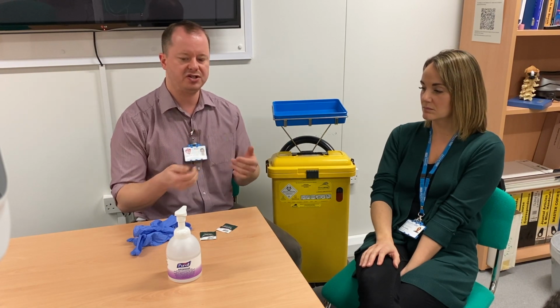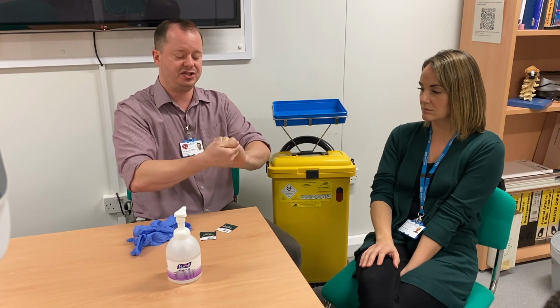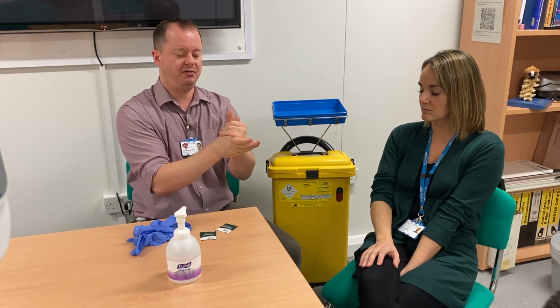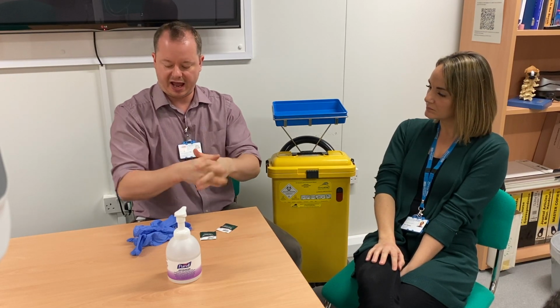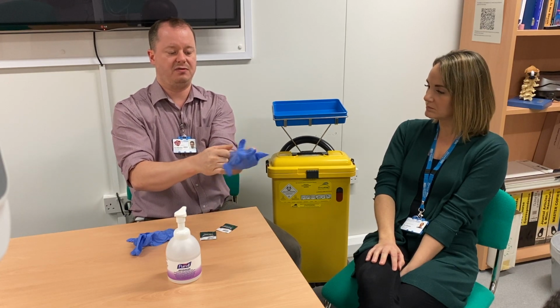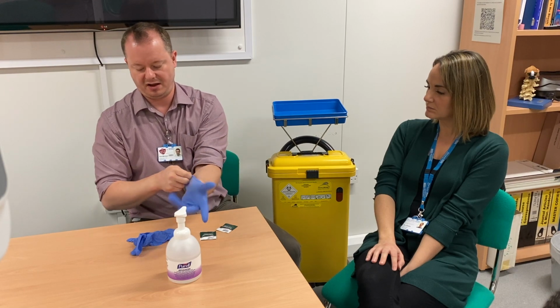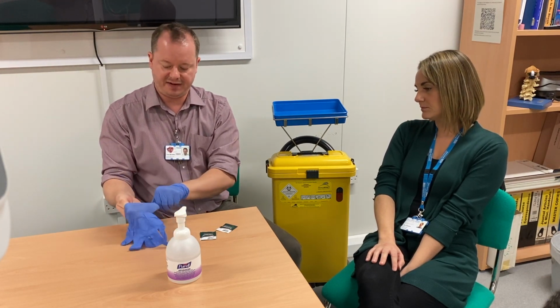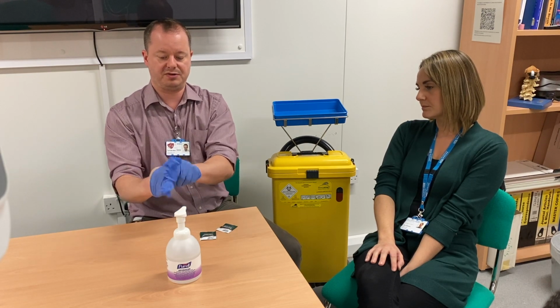Before approaching your patient, we want to make sure that you perform really good hand hygiene. Make sure that you clean your hands according to the World Health Organization guidelines, and that you get a pair of gloves on. Whatever size you are, we want you to put those on so you can perform this skill safely, not only for you but also for the patient, so you're trying to protect them.